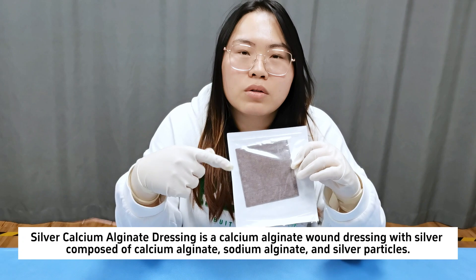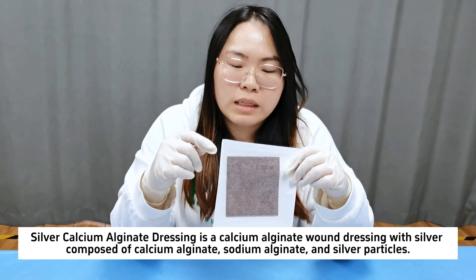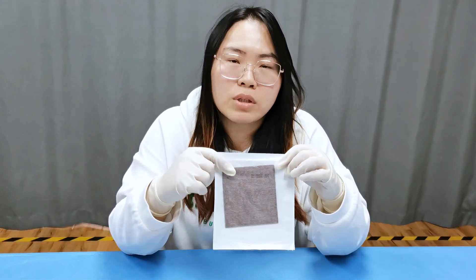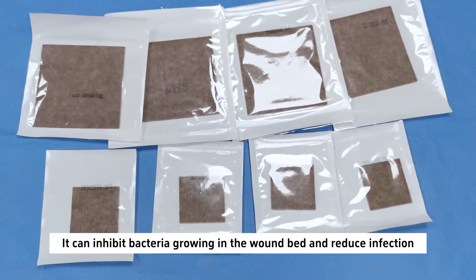Silver calcium alginate dressing is a calcium alginate wound dressing with silver, composed of calcium alginate, sodium alginate, and silver particles. It can inhibit bacteria growing in the wound bed and reduce infection.